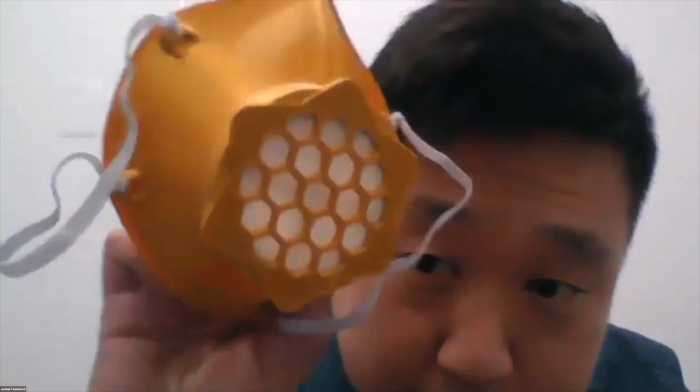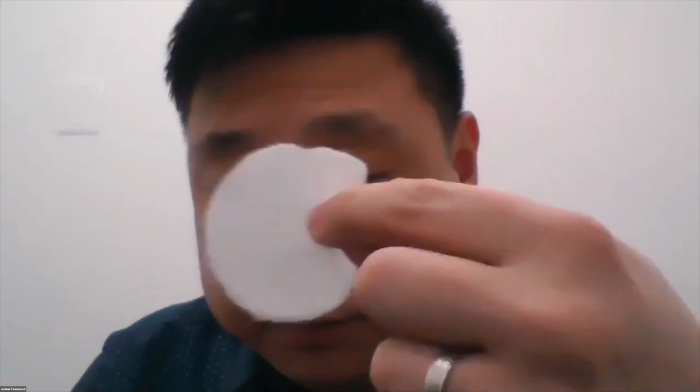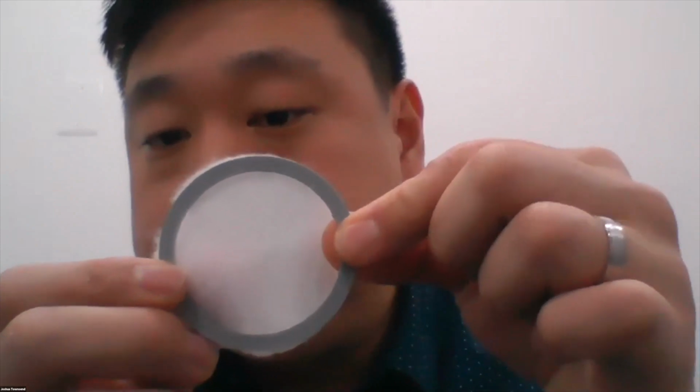Yeah, sure. So first, here's my final face mask design. I'll put it on real quick too. With this one, I put on some ear straps. With the straps you have available, you can do a head strap, which may be more comfortable for long periods of use. Let me take this off here. I'm going to unscrew the cap. We have our washer in between here. I used the washer as a guide to cut out this filter.